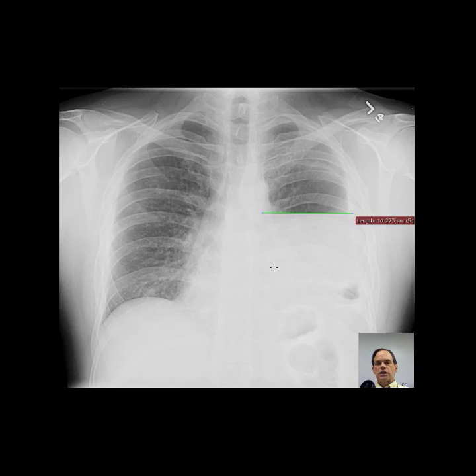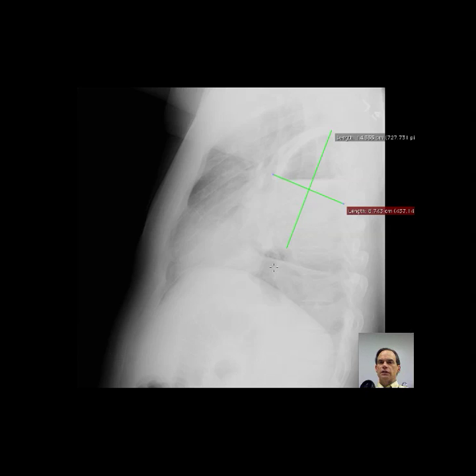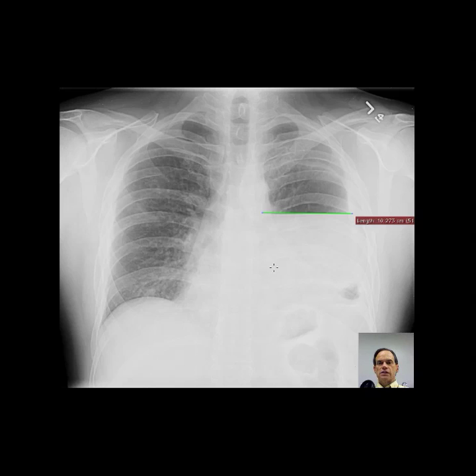Impression: Large fluid collection in the left hemithorax with air fluid level. I suspect this is a loculated collection within the left pleural space, or possibly a pleural abscess. An intrapulmonary lesion with air fluid level cannot entirely be excluded. Chest CT is therefore recommended for further evaluation.